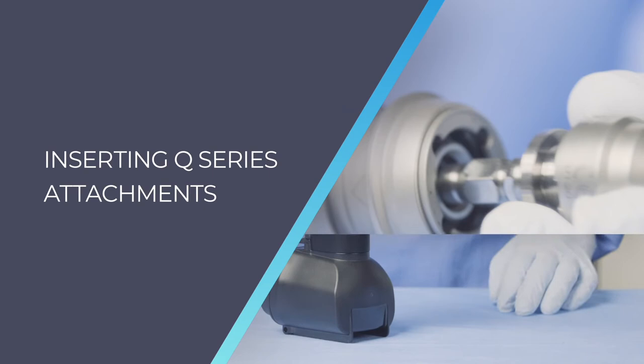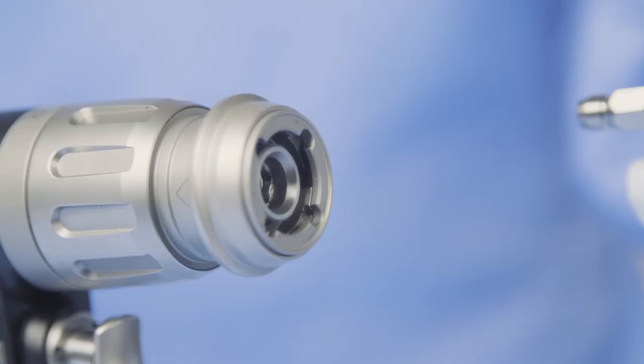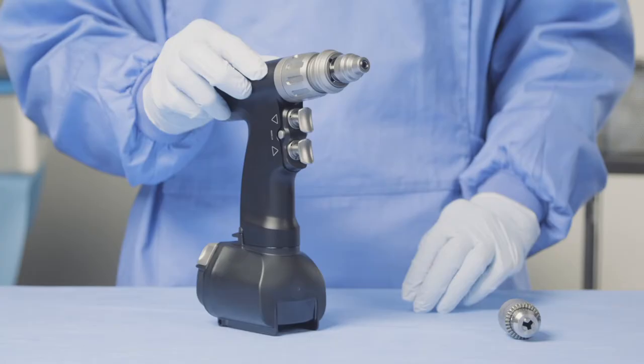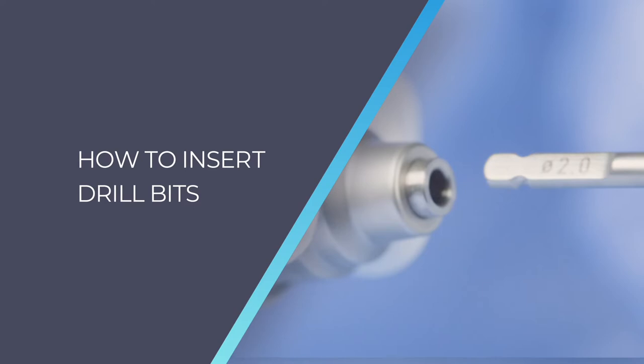Inserting Q-series attachments into your MBQ handpiece couldn't be more simple. You simply take them and insert with a push and click. To remove the attachment, simply pull back on the collar here and slide straight out. Let's take a look at how to insert drill bits.